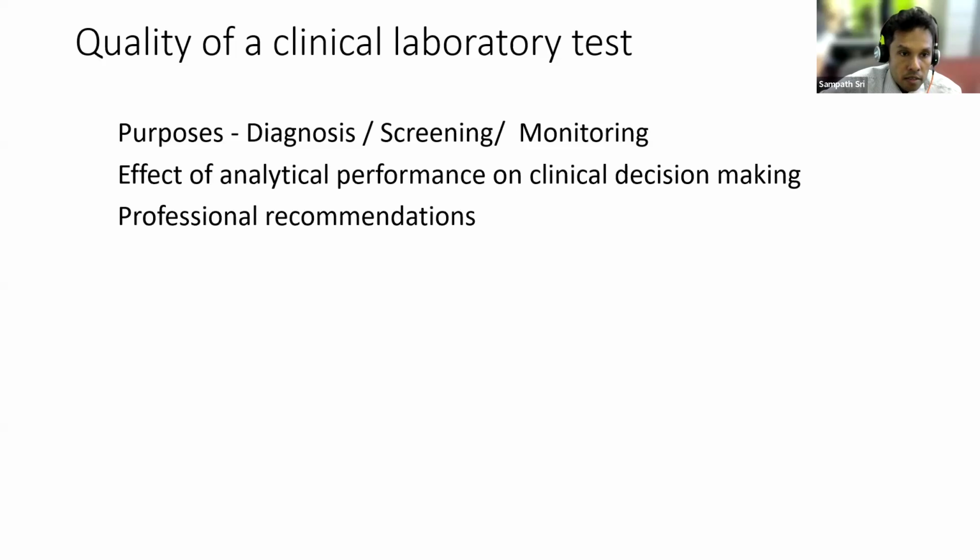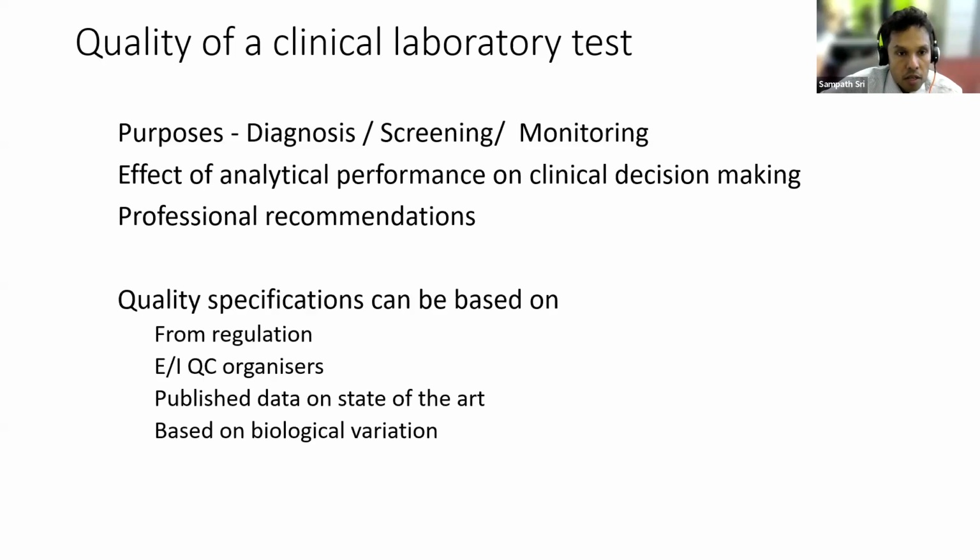There are various recommendations from professionals about the quality of these clinical laboratory tests, and we can use these recommendations to set our quality specification in our QC program.